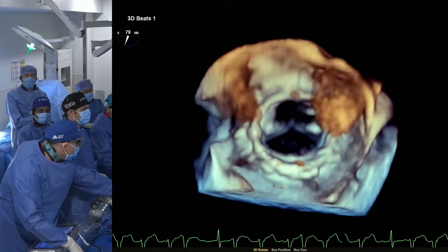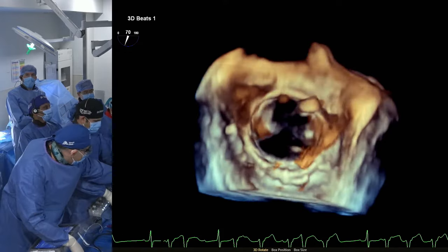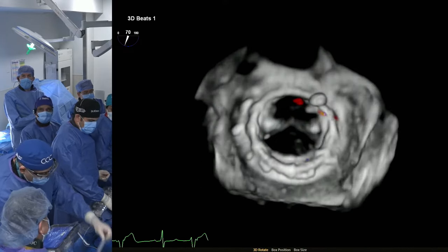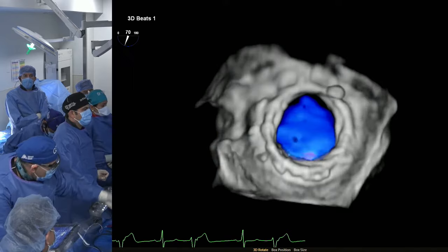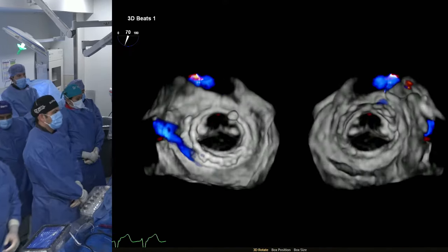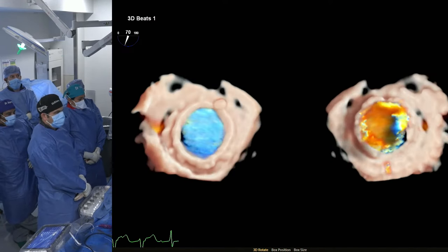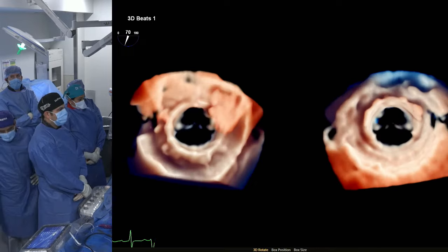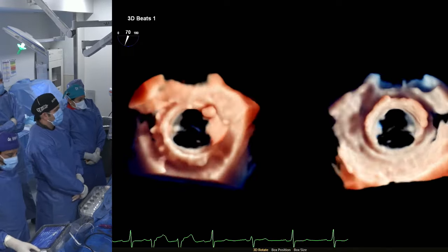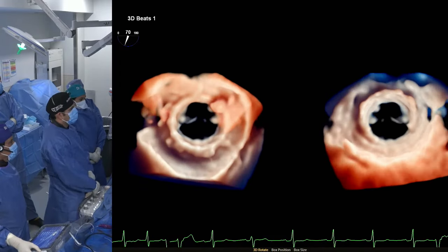So you can see the valve in the middle. In this case, while going up, we definitely had to adjust. Minimal, if any MR. So the trick is, the second person has to have a lot of coordination here. Go very slow. And the first person is doing micro adjustments, as you were seeing. Dr. Kinney was doing very tiny micro adjustments to land up exactly where we wanted. It was a beautiful illustration, step by step, absolutely perfect.